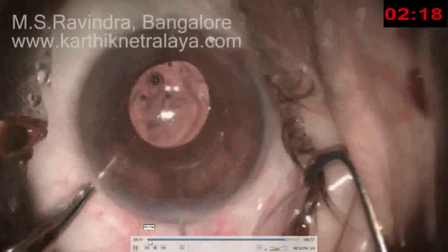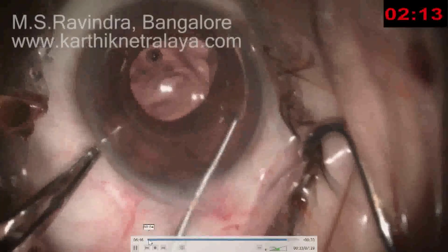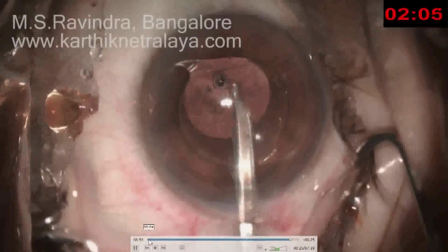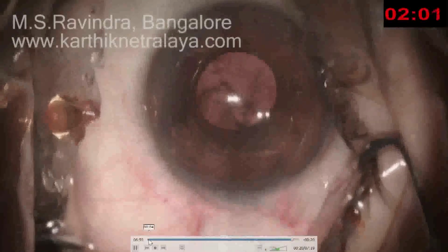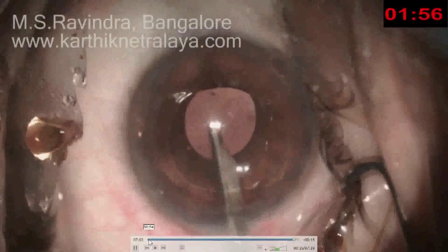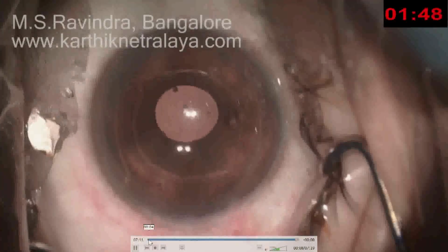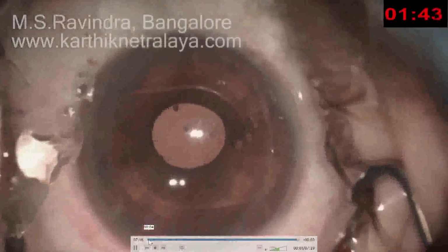is repeatedly infused. Visco is aspirated completely. If necessary, vitrectomy could be done even here in case of vitreous presence. Sizing is important. As you can see, the pupil should be round and it should not be peaked towards the haptics. By carefully planning the surgery, we can avoid endothelial damage, prolonged inflammation, UGH syndrome, and secondary glaucoma in such cases. In certain special situations, ACIOL can certainly be an alternative to the iris clip or scleral fixation lenses. Thank you.